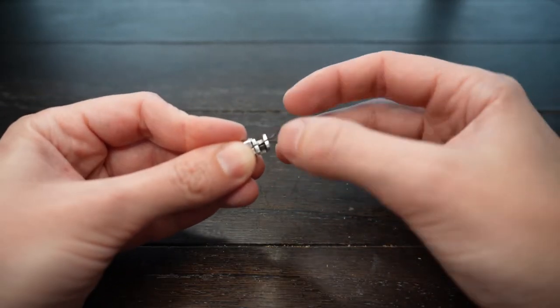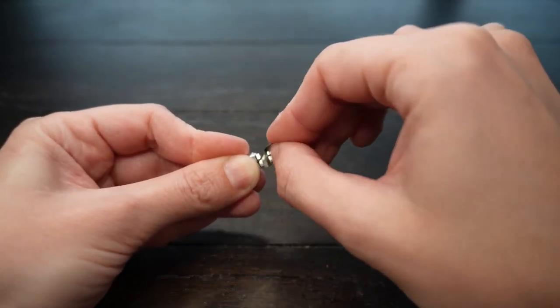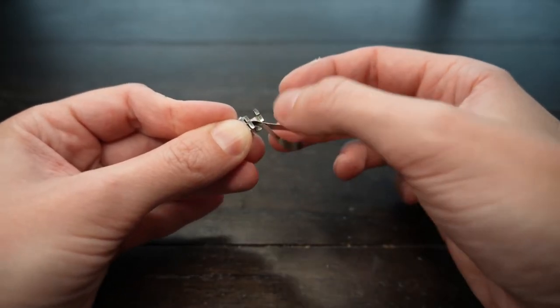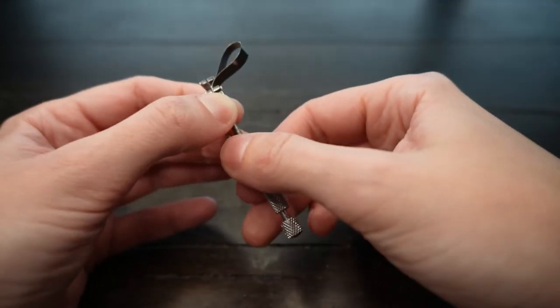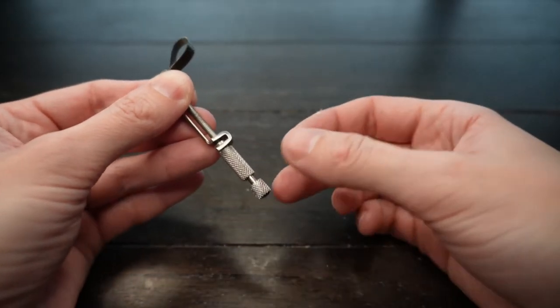You can keep it in a straight slot, or you can obviously go this side. I'm gonna work on the lower left molar, so I will place it on this side. That way the Tofflemire will be positioned out of the patient's mouth on the buccal side.